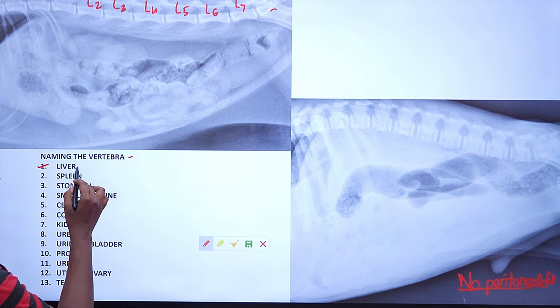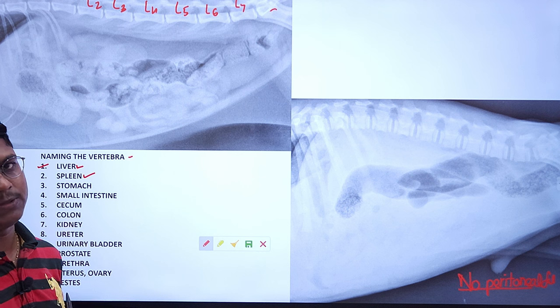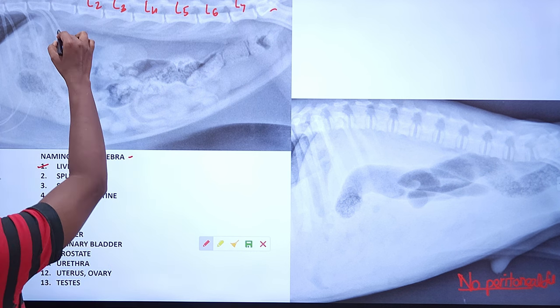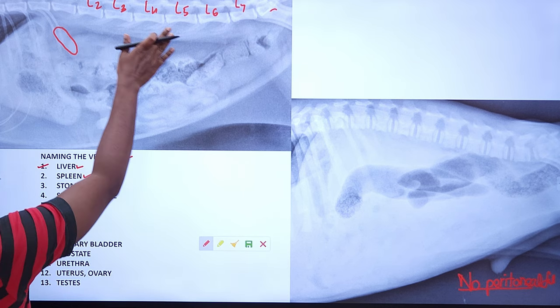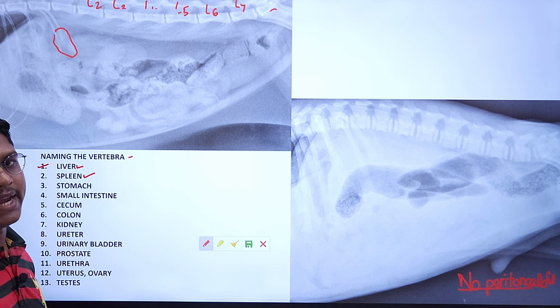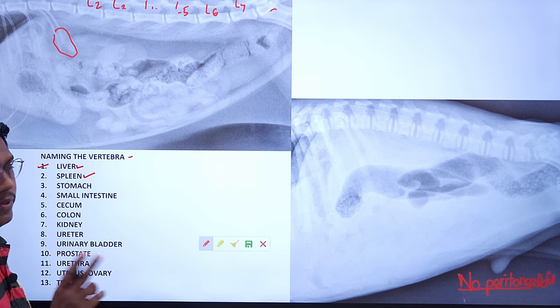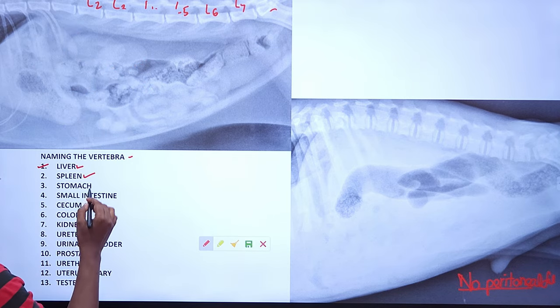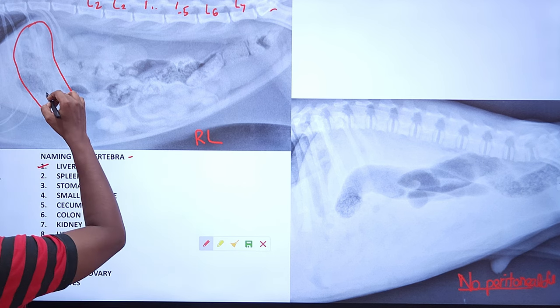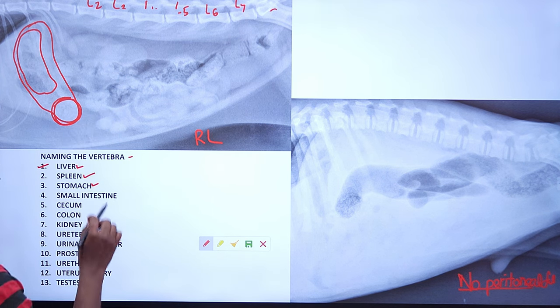Regarding the spleen: in the lateral view, the head and tail of the spleen are visible in dogs, but in cats the tail is usually not visible — only the head is seen. The head of the spleen is fixed by the gastrosplenic ligament, while the tail is more mobile. For the stomach in right lateral: gas accumulates in the fundus, making it clearly visible, while the pylorus appears as a soft tissue structure.